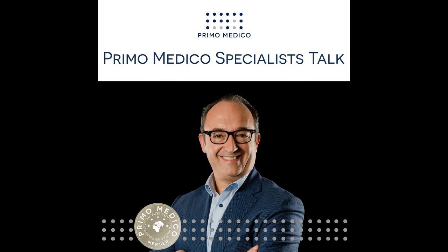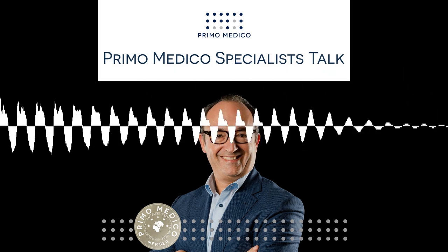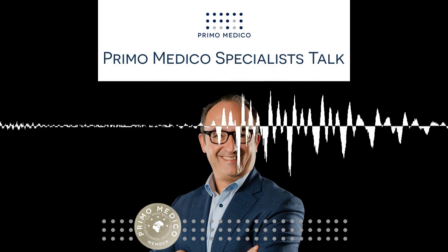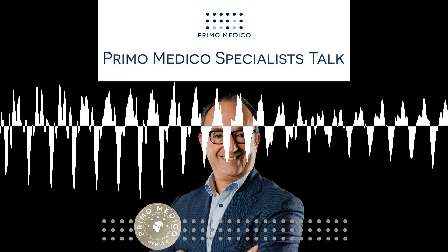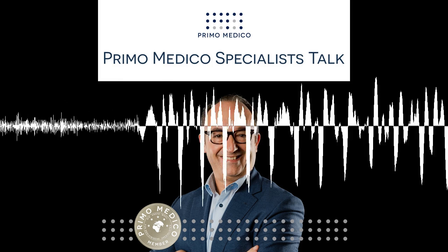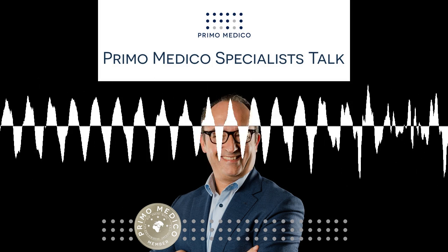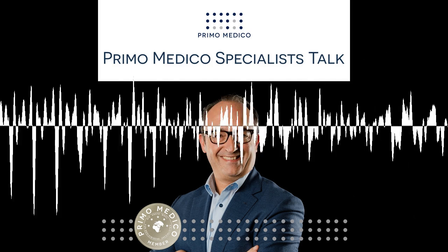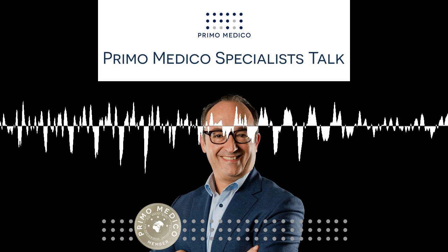Which movements and loads are possible with a total ankle arthroplasty? Well, the modern total ankle arthroplasty of generation 5 that we are using nowadays are designed for a normal range of motion of an ankle joint. So you get on average 20 to 30 degrees dorsiflexion and 30 to 40 degrees plantar flexion. So almost normal or normal. The prosthesis is designed for having a normal life.